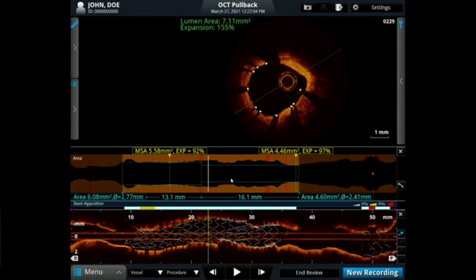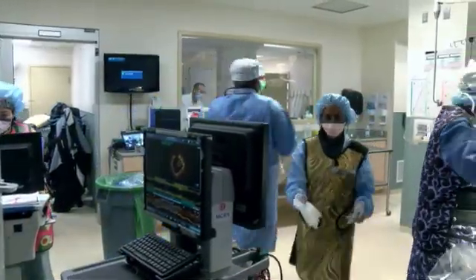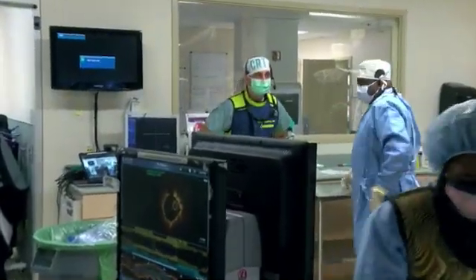Certainly. Thank you. Appreciate it. Well done. Anything else you want to add? No, I think it's all good. Now he has two shockwaves. It was part of the trial, and now he has the RCA commercially. So he's doing great. Very good. Thank you.